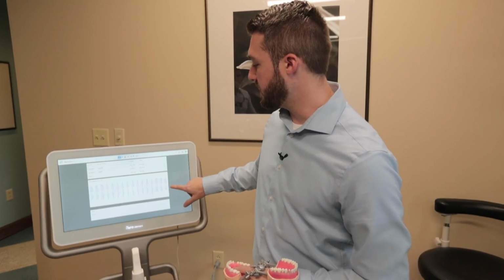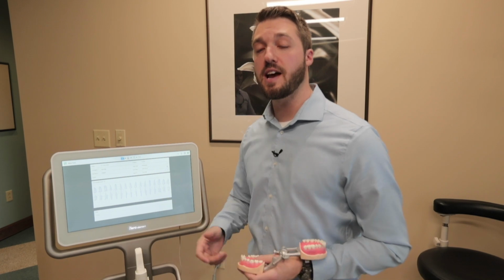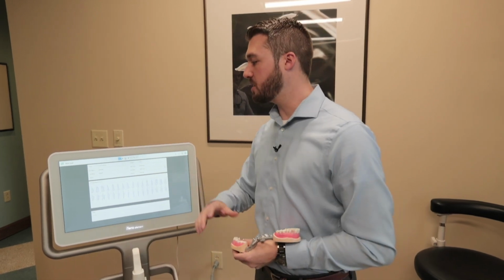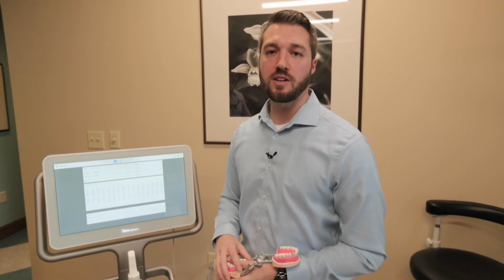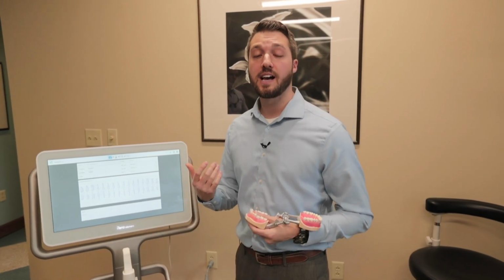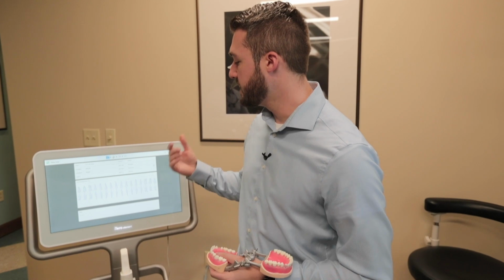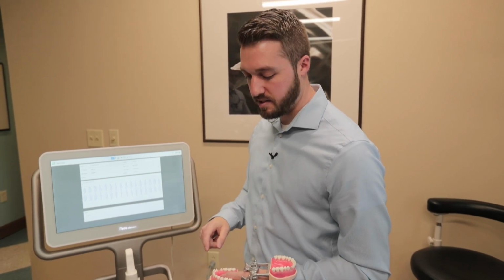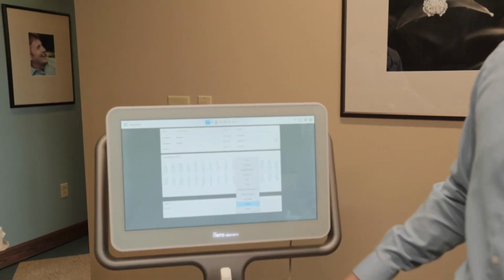What's nice is as you're filling this out, it all links to our portal, so you can actually have an office assistant set up all your RXs beforehand in the morning, so that as you come in for the day, it's already filled out. And maybe the only thing that's not in there is the material type, because as you're cutting down the tooth, you decide, hey, I need to do a different material than you originally had marked. So we try to make it easy and give you the options to do whatever you want. All right, so we're going to do a single crown on tooth number 19. We simply touch 19.